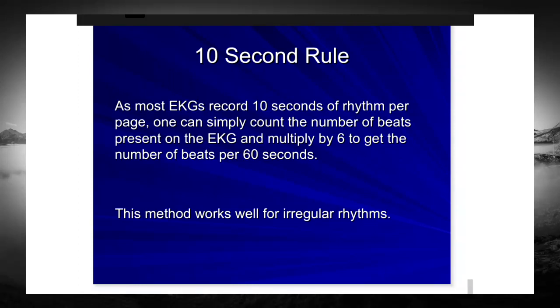The 10-second rule: most ECGs are recorded in 10 seconds. So when you get that standardized page, it's usually 10 seconds of time. And so we remember, again, the QRS represents what? Ventricular depolarization. What is ventricular depolarization in the real world? What do we call that? Heartbeat. Perfect. So if I were to have a patient lying in front of me and I wanted to figure out their pulse, what would I do?